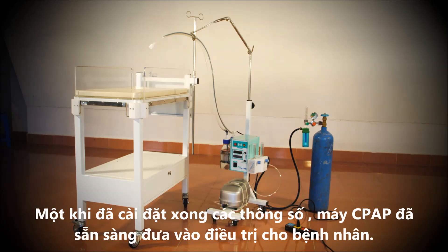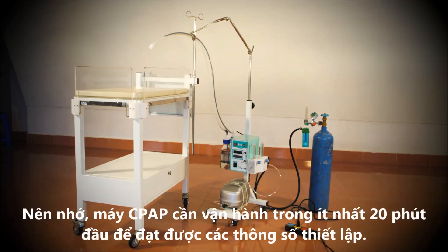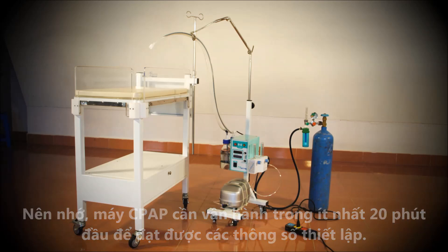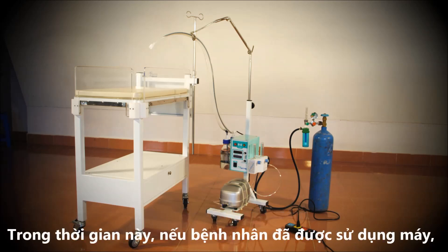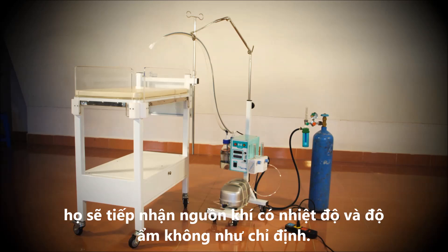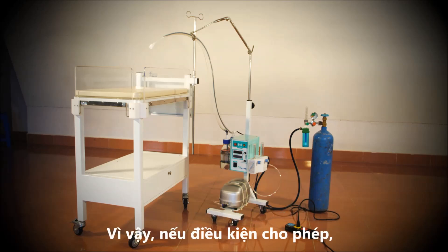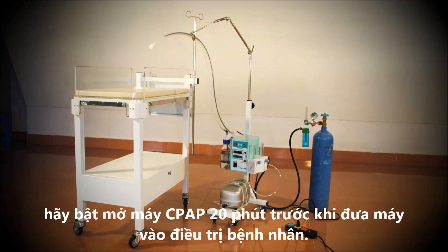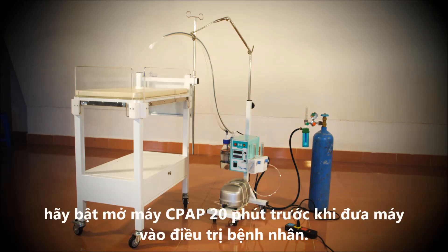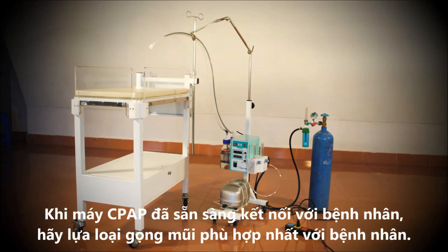Once all the parameters are set, the patient can be connected to the CPAP machine. Remember that it takes up to 20 minutes for the CPAP to reach all set points. During this time, the patient will not receive gas with the desired humidity and temperature. Therefore, if the situation allows, it is recommended to start the CPAP machine 20 minutes prior to connecting the patient.